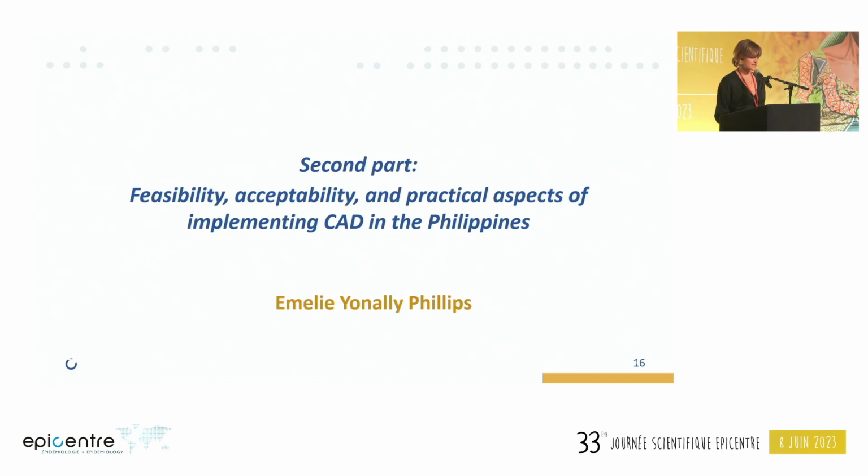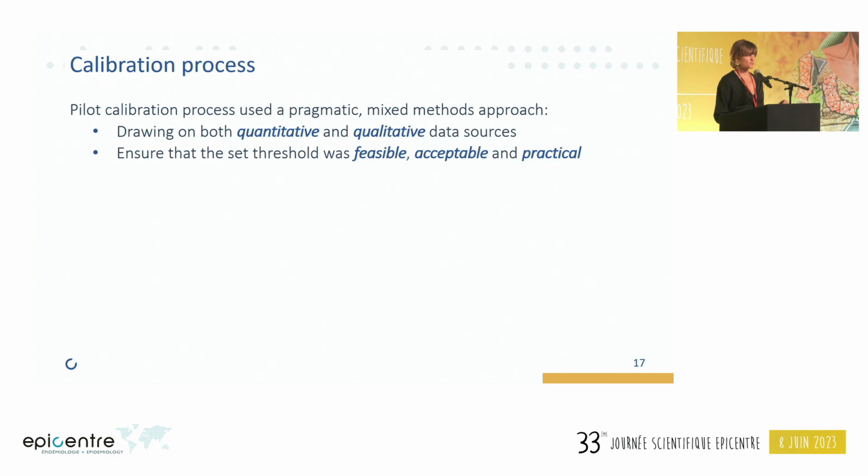So I'll be presenting a few of the key qualitative findings from the healthcare workers around the feasibility, acceptability, and practicality. A really critical component of this implementation was piloting a pragmatic approach to calibrating the CAD software to the local context, particularly because the recommended calibration processes currently rely on access to large sets of X-rays, which just aren't available in most of the places we work.